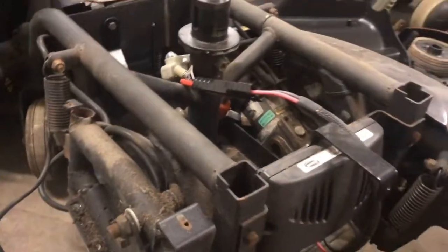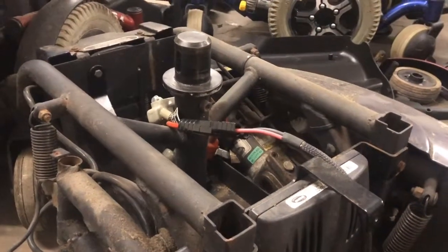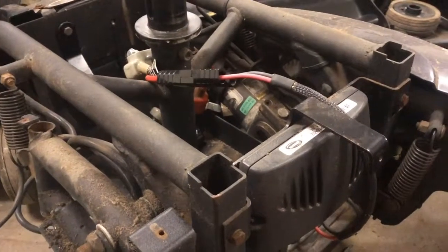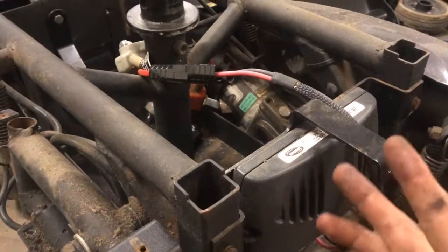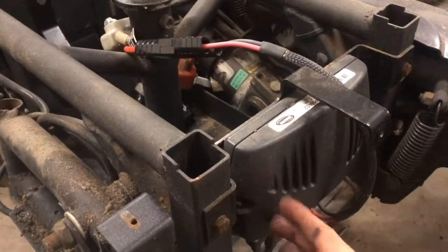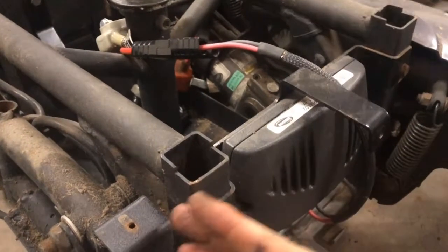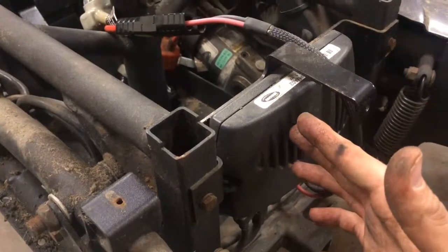It may not even be your problem. If you're getting a flash code, it could be the batteries are extremely low, or the joystick is throwing a flash code, which you need to be careful about, because sometimes in our case, they're not always correct. We've actually had a controller throw a joystick fault code, and we changed the joystick, a brand new joystick. It still threw the same code. And what happened was the soldering that controlled that port was bad on the motherboard, which in turn threw a joystick code. Same thing with a motor code, it'd be something in here that's connected to what controls the motor on the motherboard and gives you a false code.